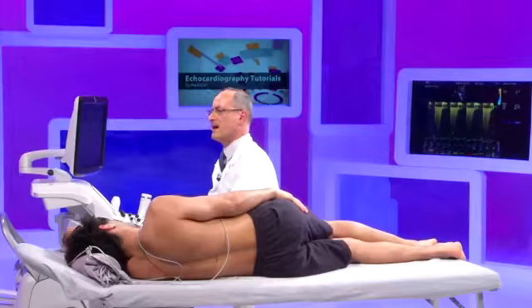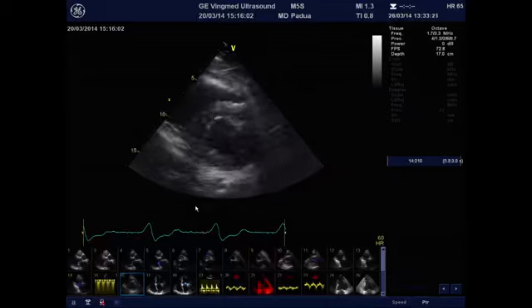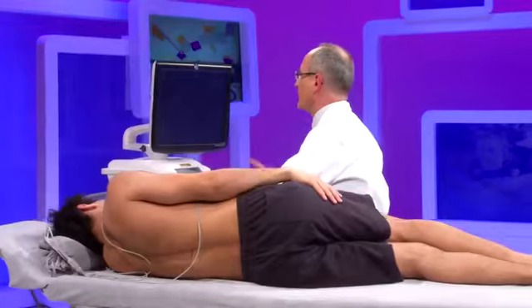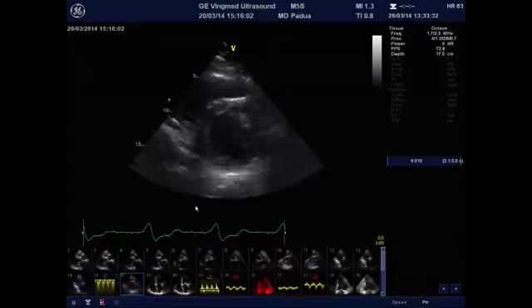Usually it's a little bit higher immediately after the transplant, when the body and the heart are adapting to the previous dysfunctioning heart. Usually it declines during the first months after transplant and then stabilizes, unless there is any complication, and usually the complication is the dysfunction of the left heart. Then I go back to my short axis view at the level of the left ventricle to have an overview of the global ventricular function. And you see here it's quite a good left ventricle in this patient.